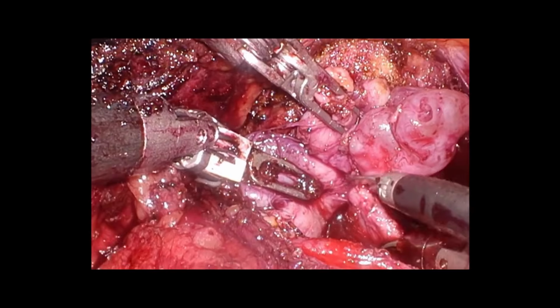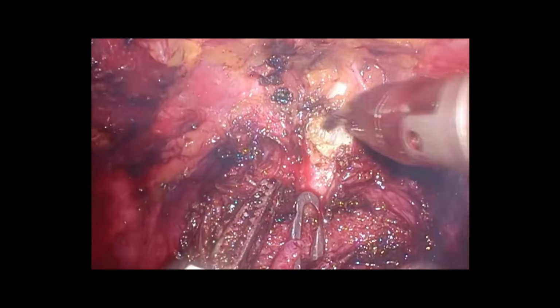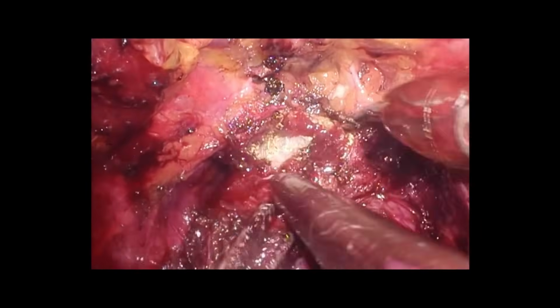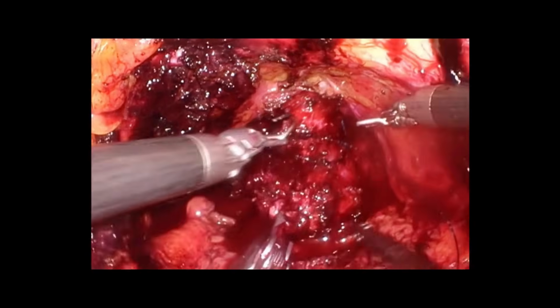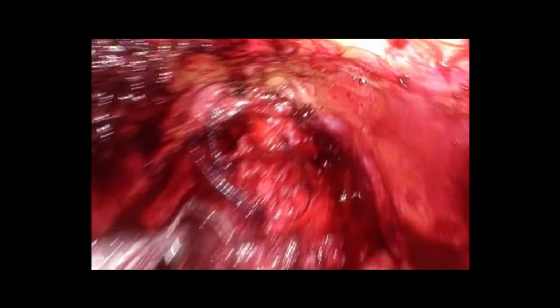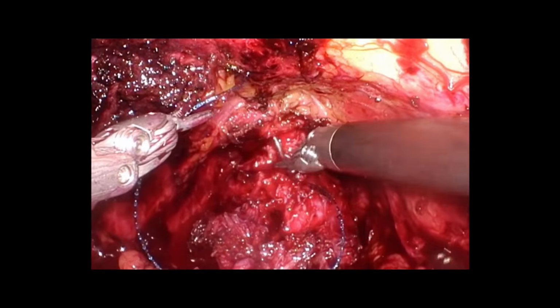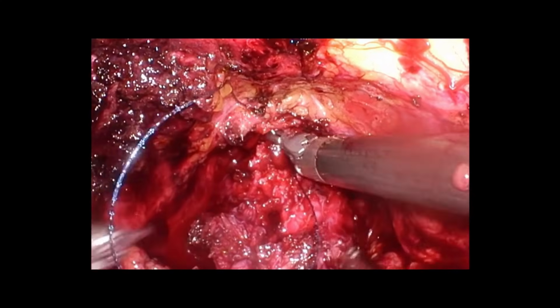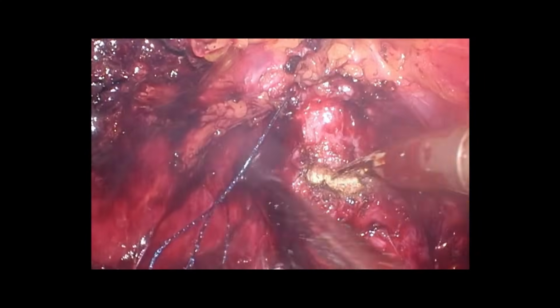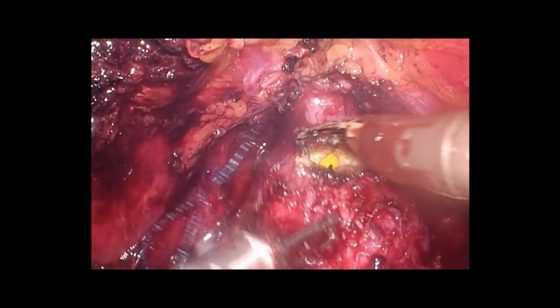Denonvilliers' fascia is cut in the midline and a posterior plane is made. The prostato-urethral junction is identified. Better to do a DVC stitch. It need not be complete, but a few stitches you can take with a 3-0 V-Loc stitch. This will give a good identification of the prostato-urethral junction without much bleeding.